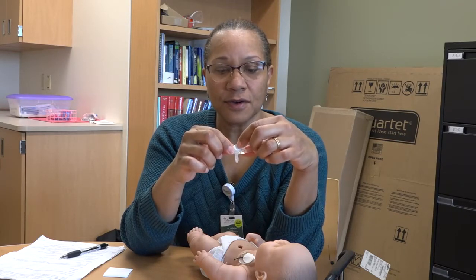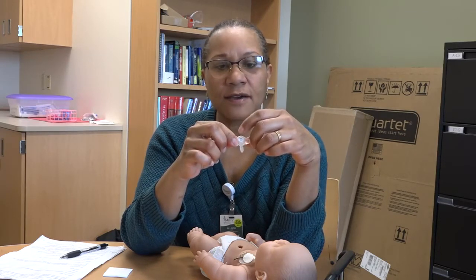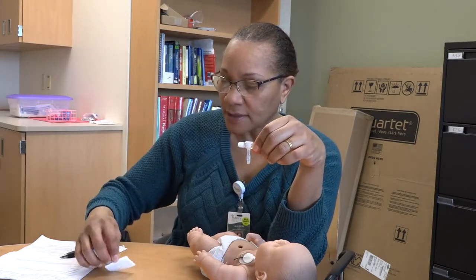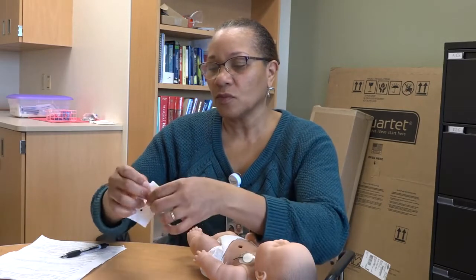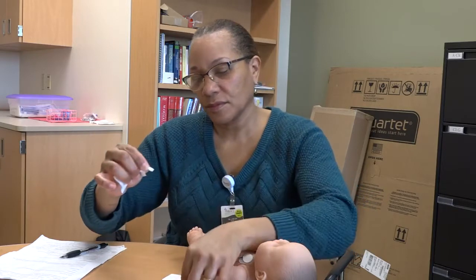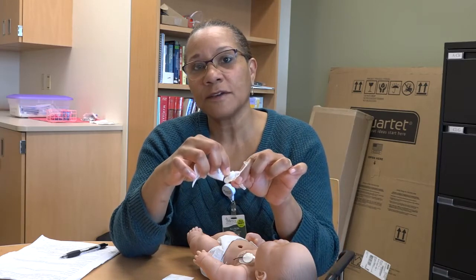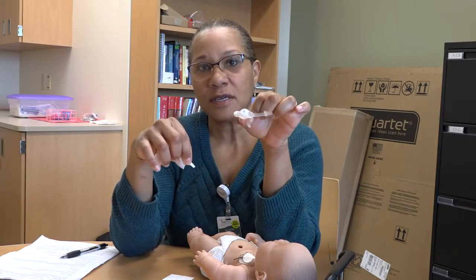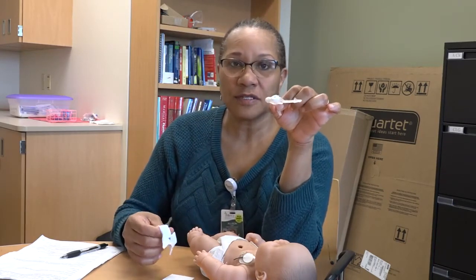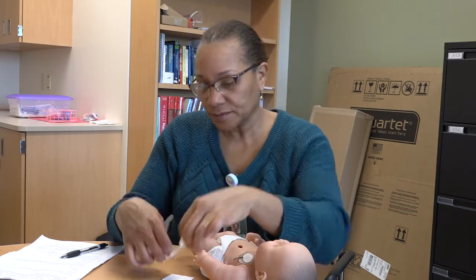The other thing you can do is, if you see any buildup of formula sitting inside here, since this hole is a little small and Q-tips don't always fit down inside, you could use a piece of gauze and twist it like a wick. Then you can put it inside there and clear up any formula you see, because we want to keep this area clean and dry, once again, to decrease any buildup on that anti-reflux valve so that it is able to stay closed.